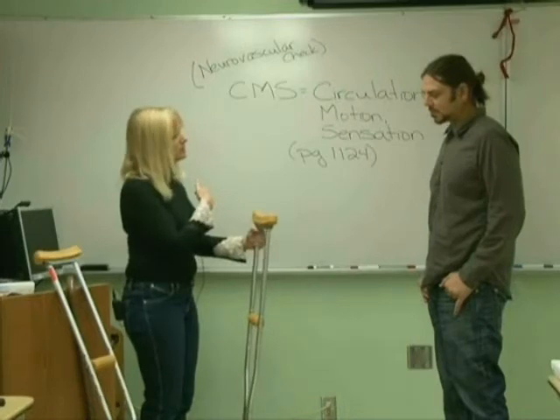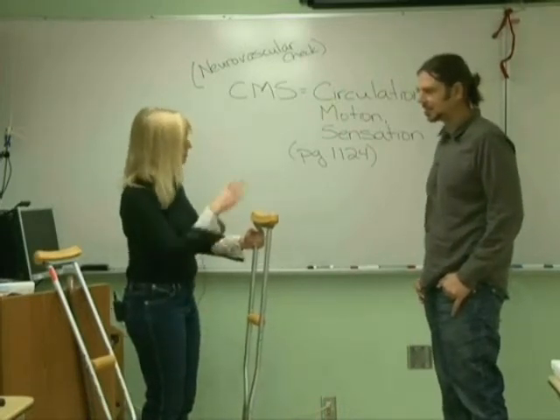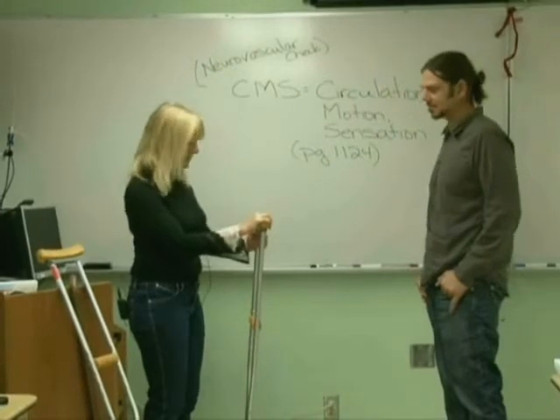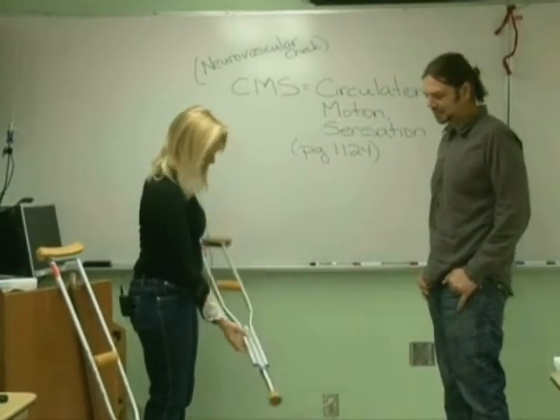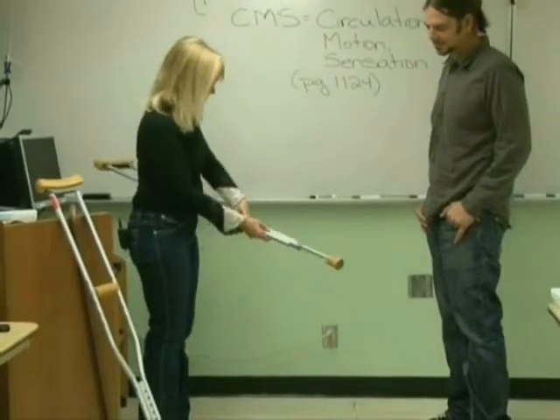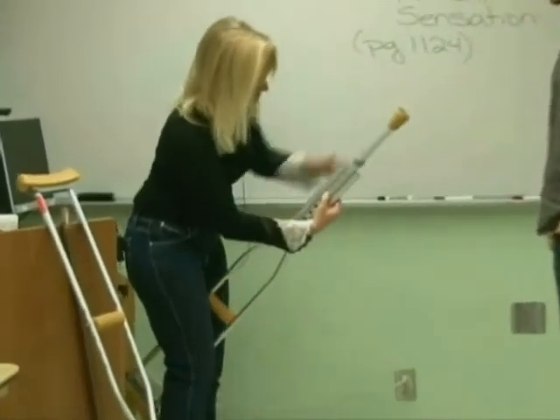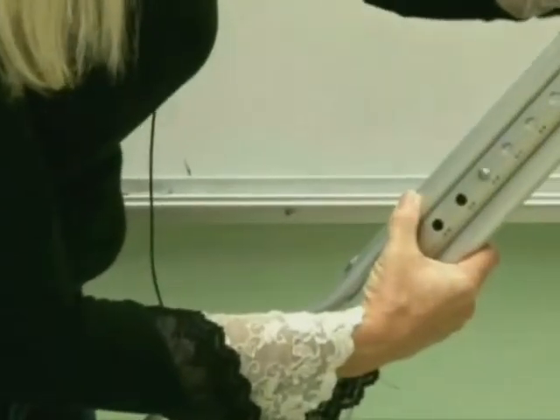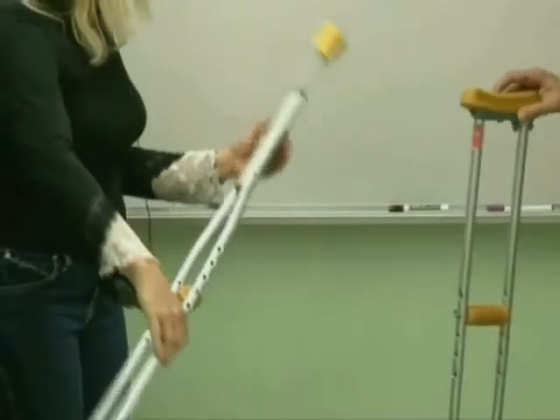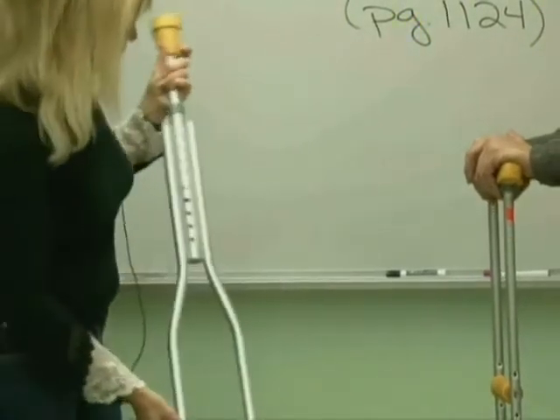I'm going to adjust these to myself and demo how to use them, then I'll get you a pair to fit you. These are adjustable by the little pins down here. There are some measurements — I'm about 5'6", so I'm going to push both pins in at the same time and push the bottom up to the 5'6" mark. You want to make sure you do both of them together so they are of equal height.